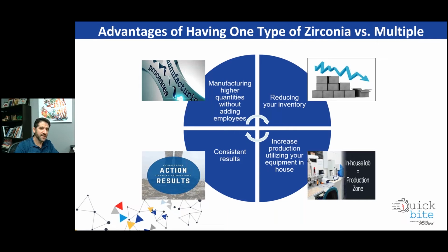And we utilize them to actually use the smart technology in this material, because it is a really smart technology. So we mill all of them, take all the A2s, all the A3s, mill them in the same A2 pack, A3 pack, and then we separate them. We take all the anteriors and put them in a program in a sintering oven that will bring us a higher translucency. We will take all the molars and put them in a lower translucency.